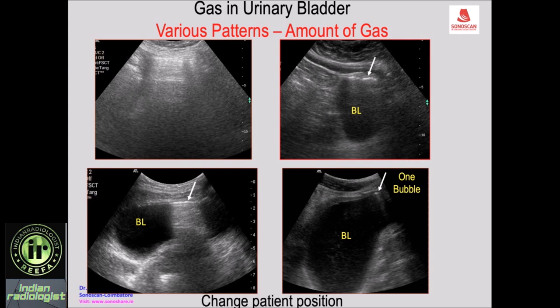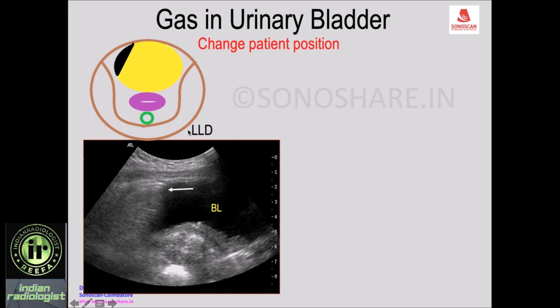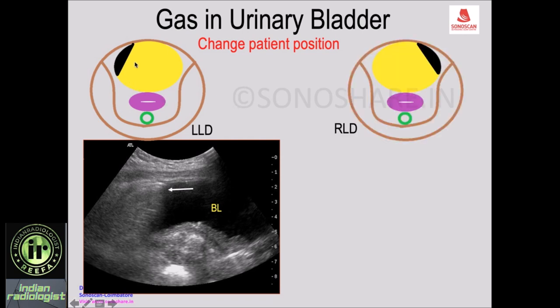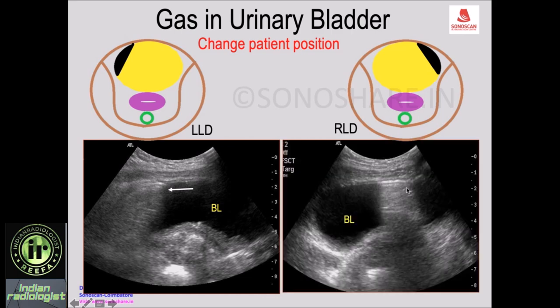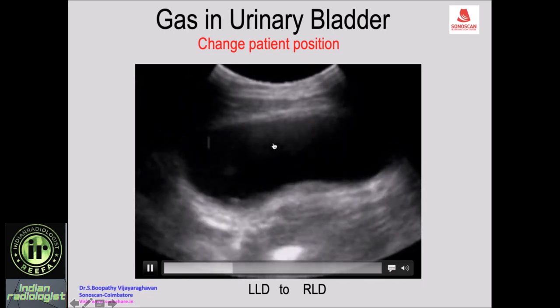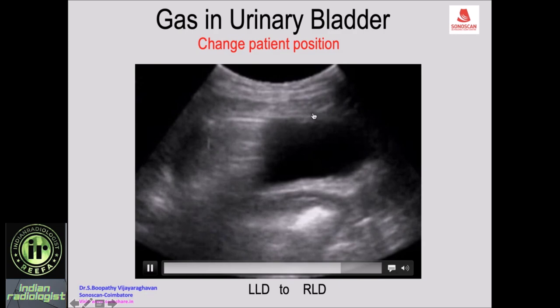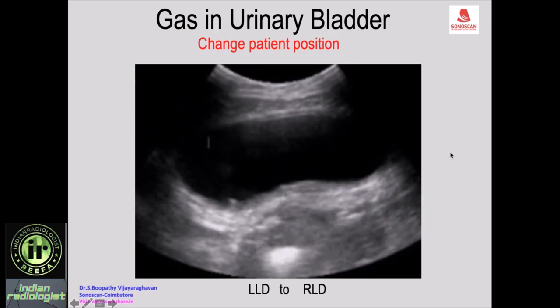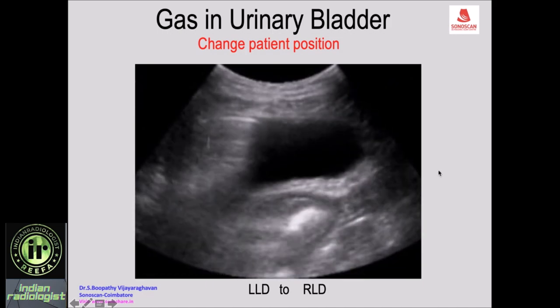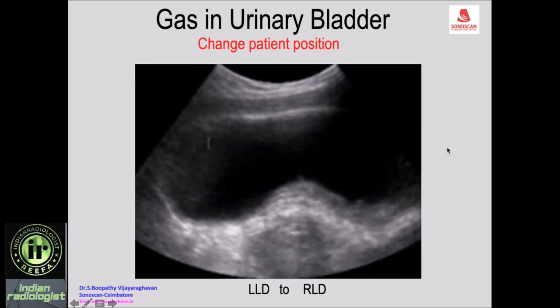Once you have seen this, you can confirm it is gas by changing patient position from right lateral to left lateral decubitus. In left lateral decubitus, the gas in the bladder moves to the right, and on a transverse scan you see the dirty shadow on the right side. When the patient turns to right lateral decubitus, the gas moves to the left side. This shift confirms that the gas is in the lumen of the urinary bladder.